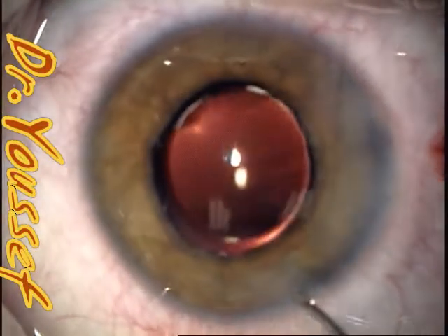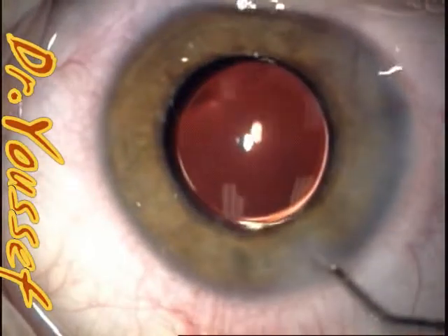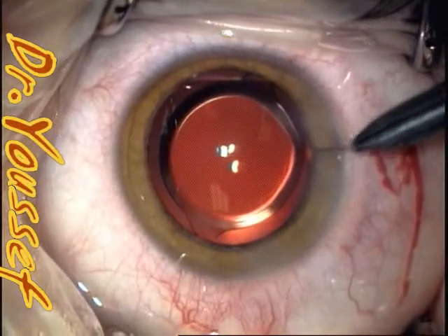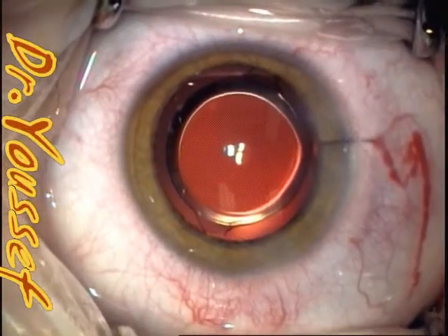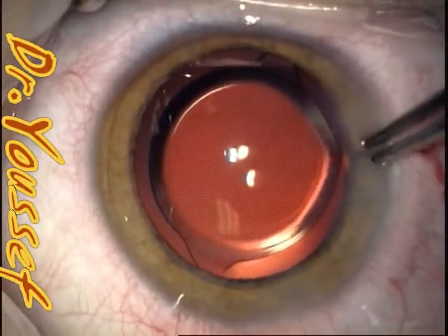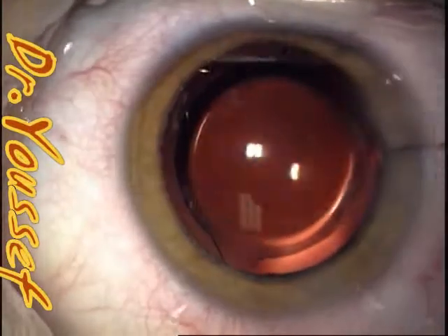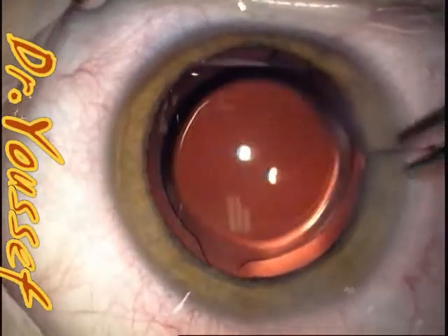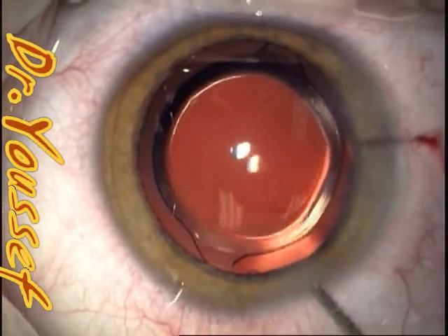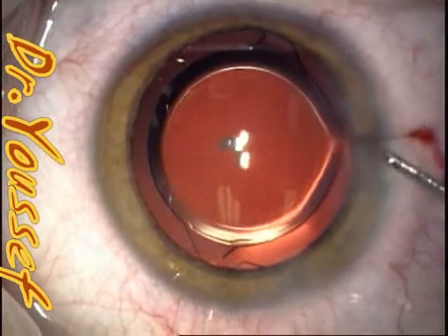It went really well. We did both eyes — again, they are asymmetrical — because we don't want to put the kid to sleep twice. The case was done and went really well. Thank you so much for watching.